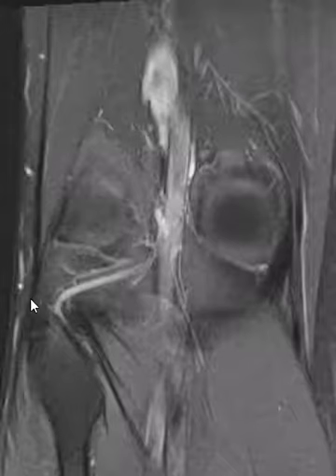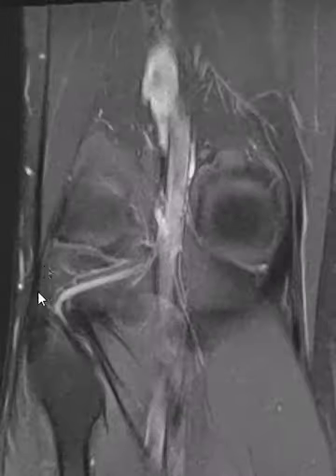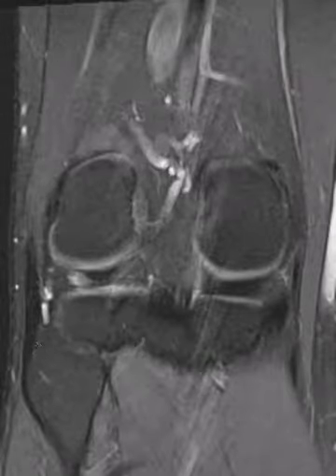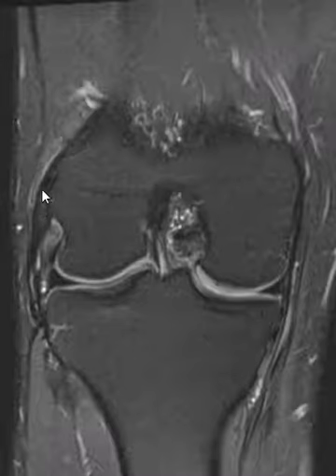And if we go towards the back here, we see this, the biceps muscle comes down. It's kind of variable how far down it comes. The muscle ends about here, and then it joins with, again, the fibular collateral ligament right here to become the conjoined tendon. So this looks good out here. We'll put up another view to see this a little bit better. But they just have a mild sprain over here of the fibular collateral ligament origin, right where they're hurting.